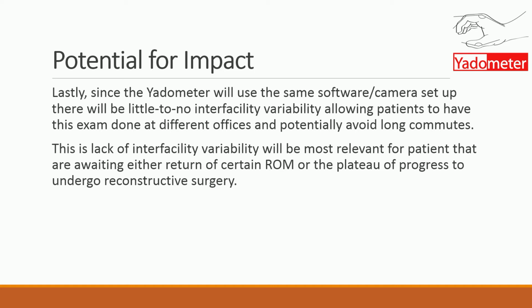Obviously, having those numbers is very important, because you're either looking at the progress or lack of progress of the plateau in your range of motion. In some cases, to determine if you're going to continue therapy or not, if it's working, whatever the therapy might be, medication, exercises, massage therapy, or any other intervention that you're using.